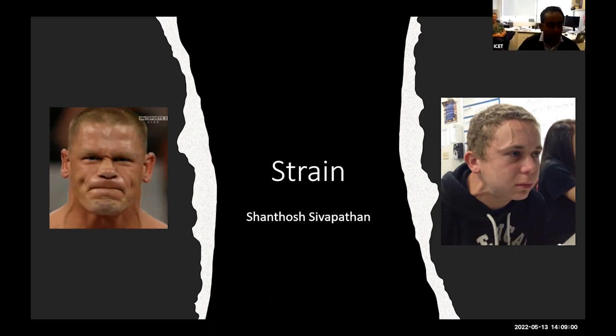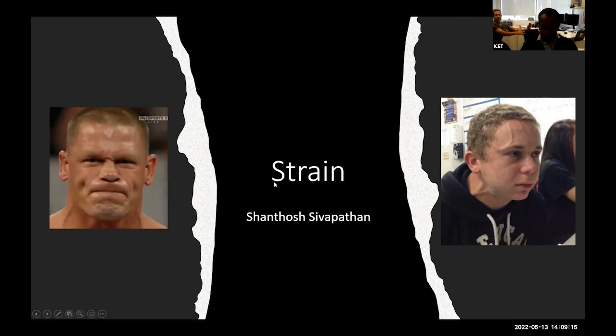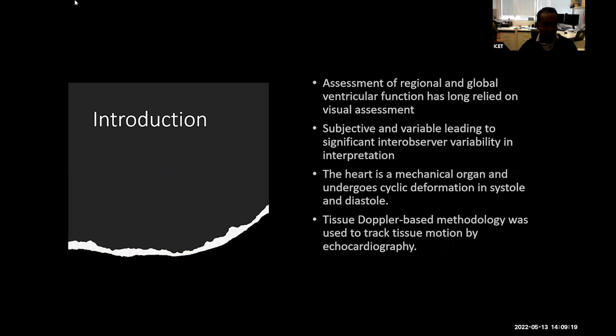I'm not sure how much understanding you guys have of strain, so I'll go through the basics and then we'll go through some of the pitfalls of doing strain and some of the clinical examples. All right, so let's see.